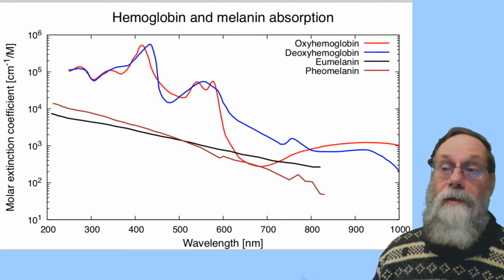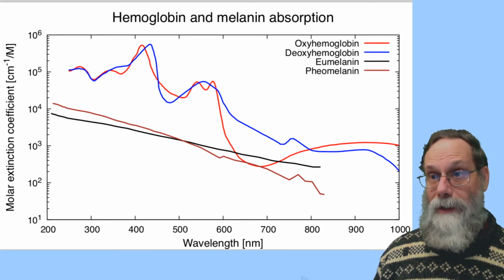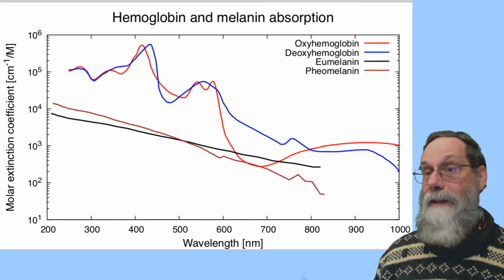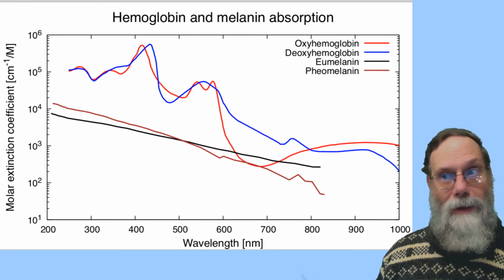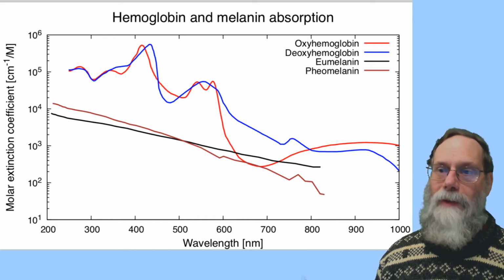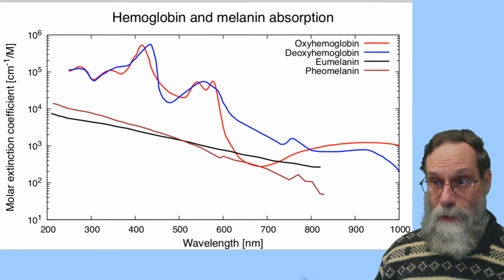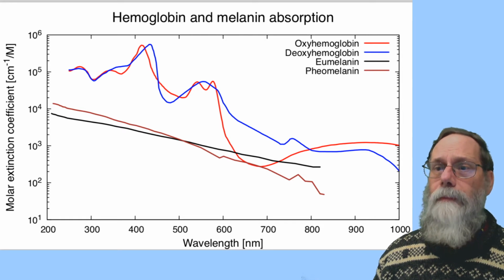What we're interested in here is how do you measure it? And the old-fashioned technique from decades ago was you stuck a needle in the person's veins or arteries and sampled the blood and did chemical analysis. And it was very expensive, invasive, basically very difficult to do. And pulse oximetry basically has almost completely replaced that.